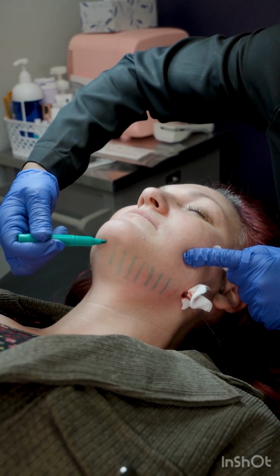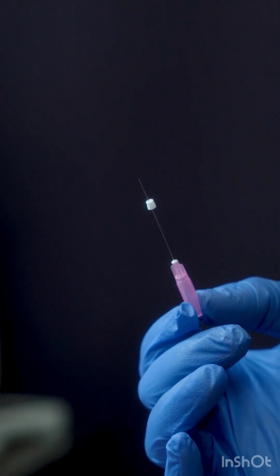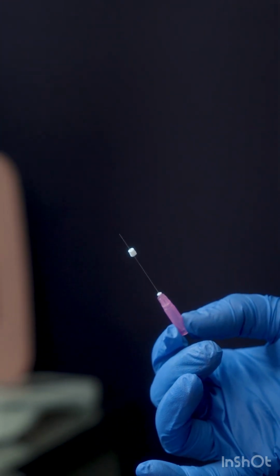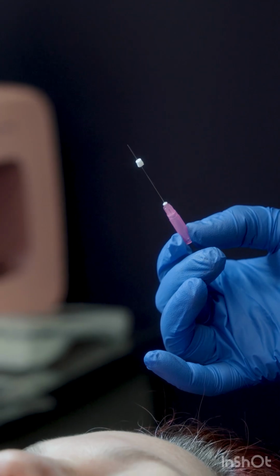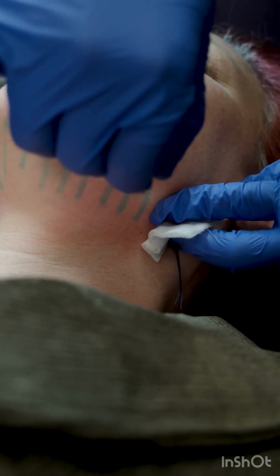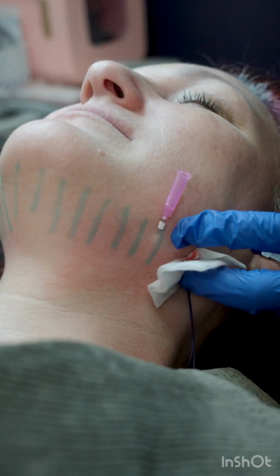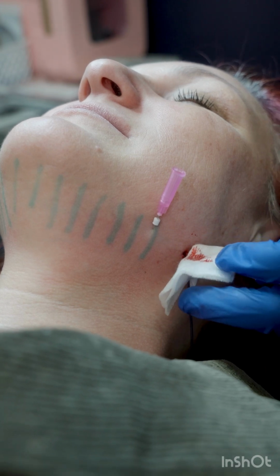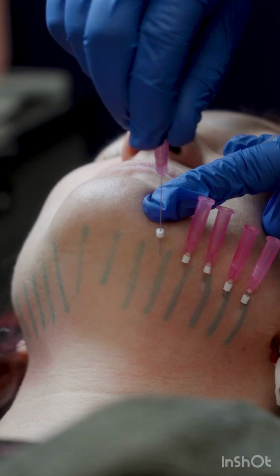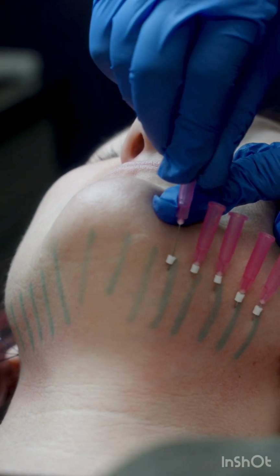The smaller PDO threads, also known as monos, are good to use in this area. Here is an example of what a mono thread looks like. These will be inserted along each track that was demarcated with a marker prior to me starting. I insert each thread one at a time along the path that I previously drew in order to provide additional contouring and tightness to her jawline and upper neck region. Please continue to watch as we insert the threads.